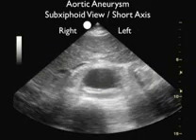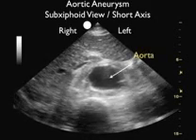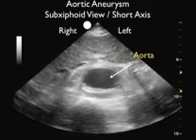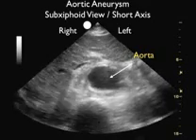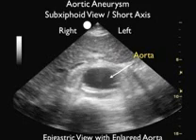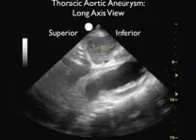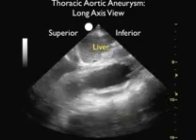This video clip was taken from a hypotensive elderly patient who presented to the emergency department with abdominal and back pain. And here we see the probe placed in the epigastric region in a short axis configuration. Notice the wide dimensions of the aorta consistent with an abdominal aortic aneurysm. Looking at this aneurysm in long axis view, we see another finding here.